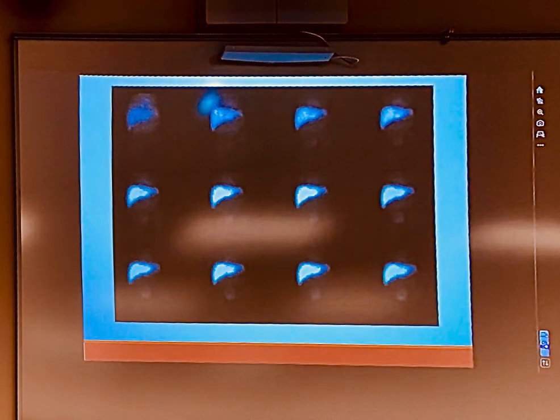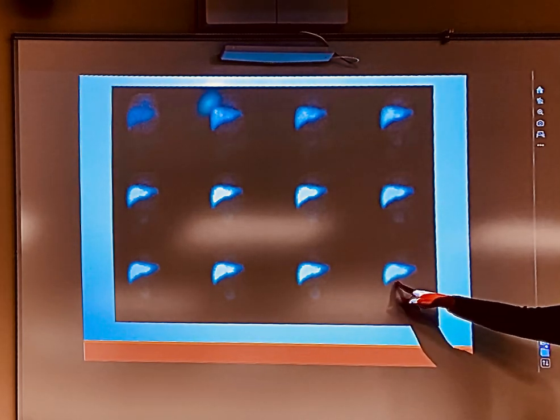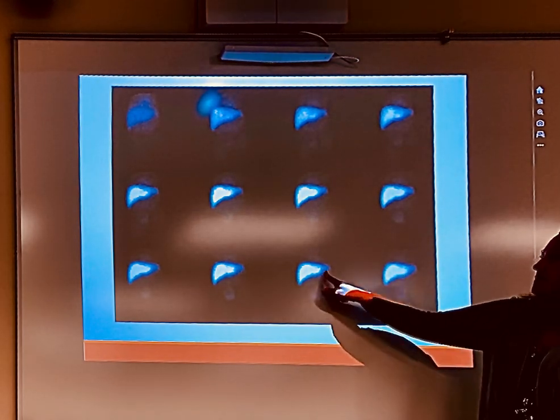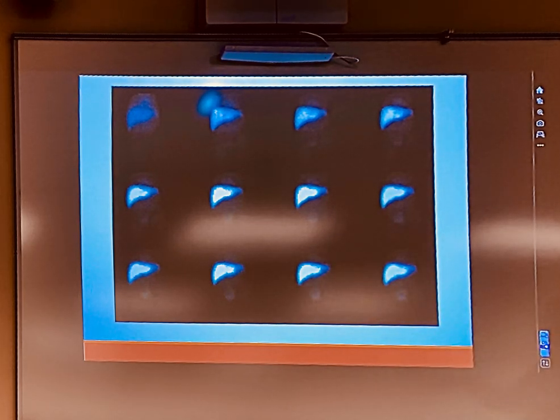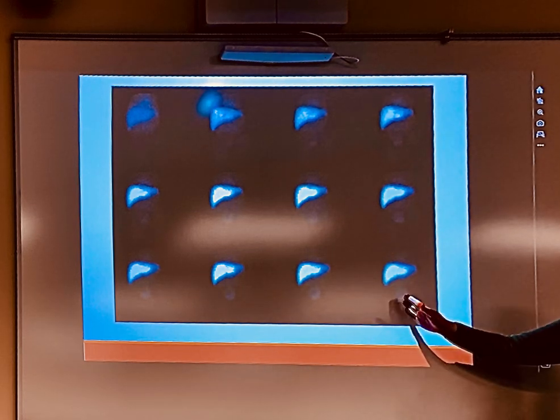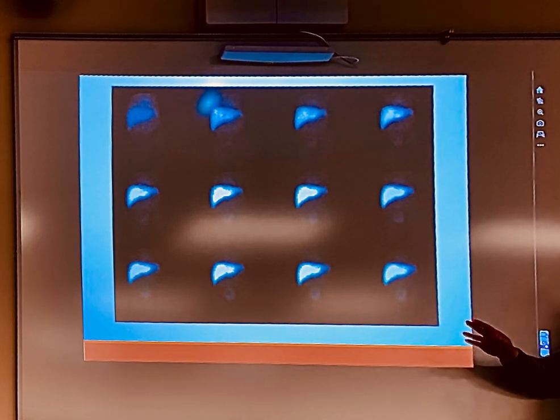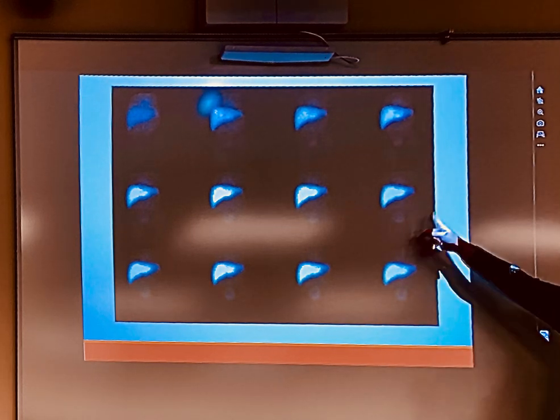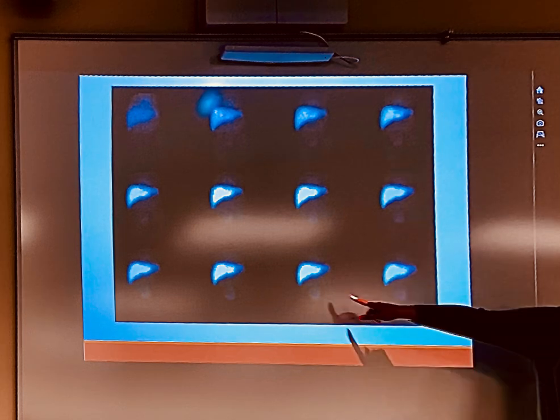Yeah, there we go. This is the biliary atresia. So here's your biliary atresia. See the activity, see how pixelated this is starting to get? So this is turned up too high. Remember we were talking about grayscales, how many colors of gray you have? This should have been pulled way to the right and turned down. The problem is the technologist wanted to prove that the baby had bladder activity. This is bladder.